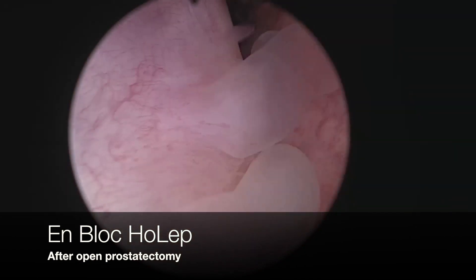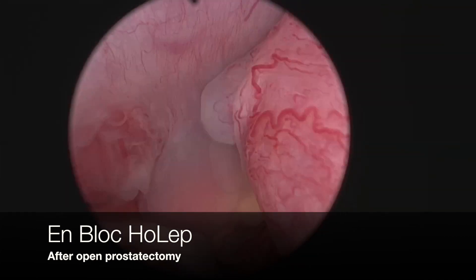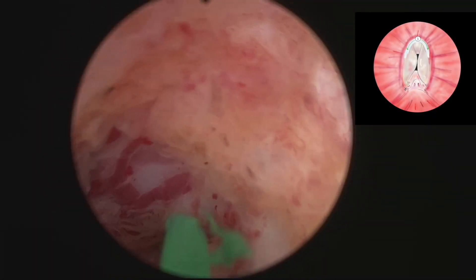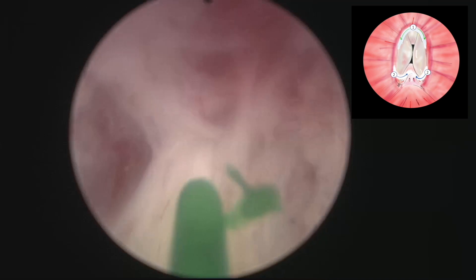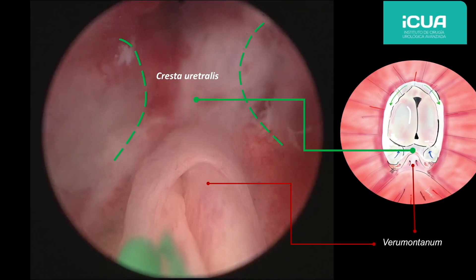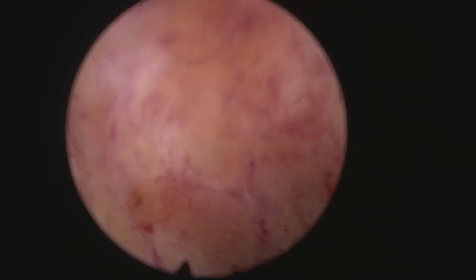This case is a patient who was submitted to an open prostatectomy ten years ago, and it was obvious that some regrowth of adenomatous nodules had taken place. The operation always starts by marking the limit of the sphincter with the apex. In this case we are using the MOSES fiber with the MOSES settings. That's the crista urethralis on top of the verumontanum, which is cut to begin separating the apex from the sphincter at the start of the procedure.